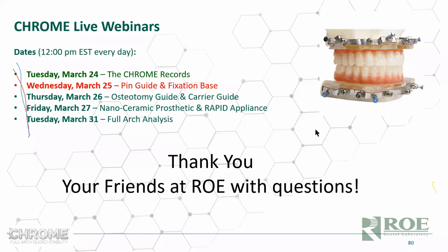Can we use gutta percha points as radiopaque markers? Absolutely. That's an age-old, tried and true way to make markers. Works very well. Use a number 5 or number 8 round burr, buried about 1 millimeter deep, put the gutta percha in. You do it at the very beginning and do the dual scan with it. A lot of times you just leave it in the denture. The denture really has a lifespan at that point. But gutta percha, yes, 6 points randomly around the arch in the pink. You don't need to put them in the teeth, but randomly, like 3 in the palate or tongue area, and the rest out on the buccal labial.